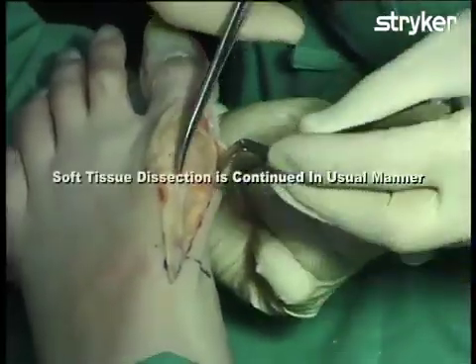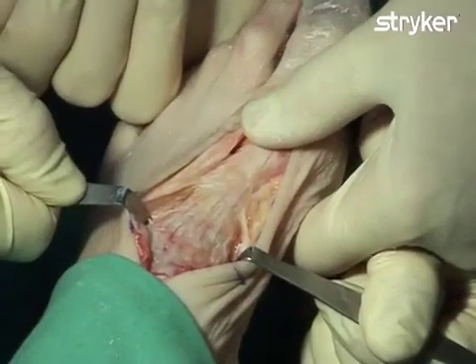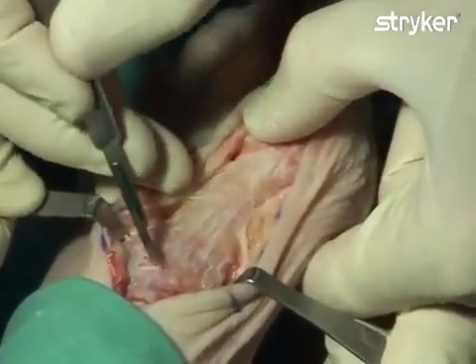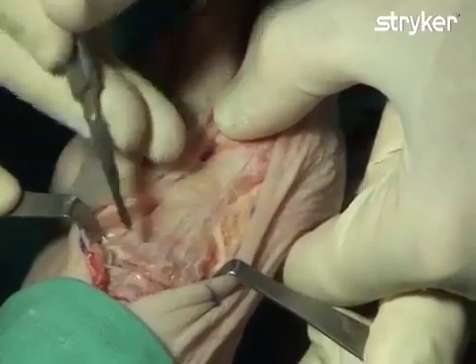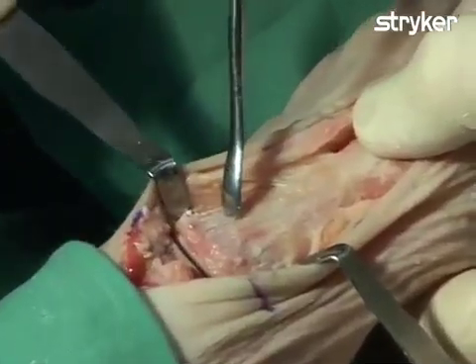Soft tissue dissection and joint exposure is then continued in the usual manner. The first metatarsal cuneiform joint is then exposed. The joint can be easily identified by observing the puckering of the joint capsule during manipulation of the foot. The area surrounding the metatarsal cuneiform joint is then incised and the joint is fully visualized, giving full access to the first metatarsal and the medial cuneiform.